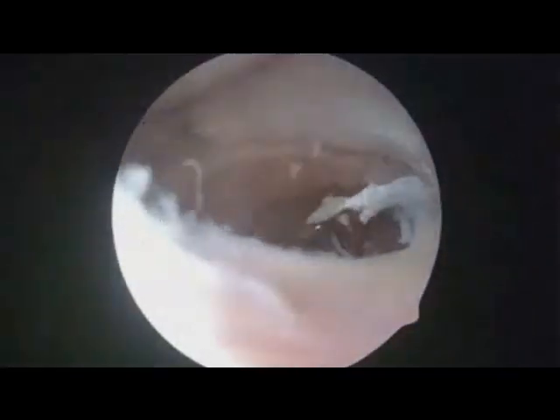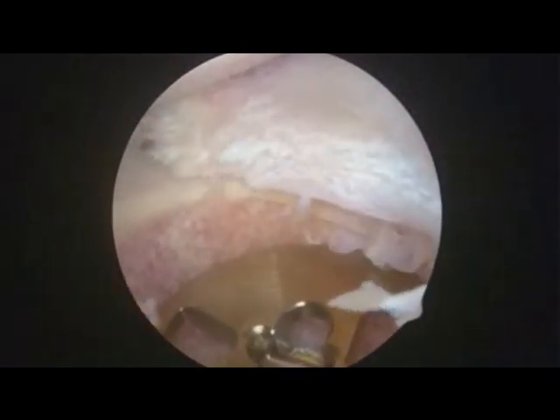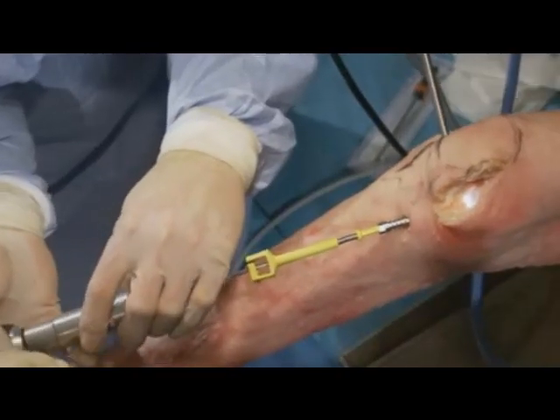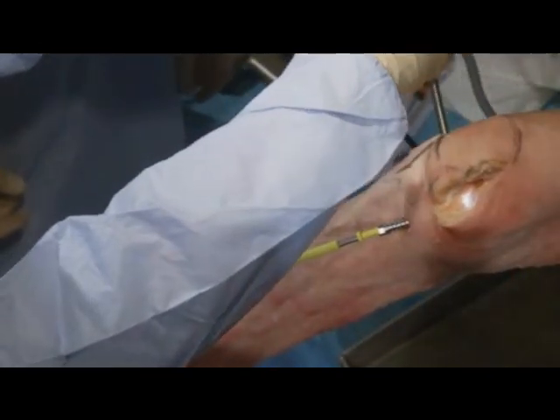Once we've cut our slot, now we need to measure to make sure that the template fits properly and we have no problems. So let's take this off, please. We're going to leave our guide in position so that we can just test to make sure that we don't need to readjust, go up or down anymore.